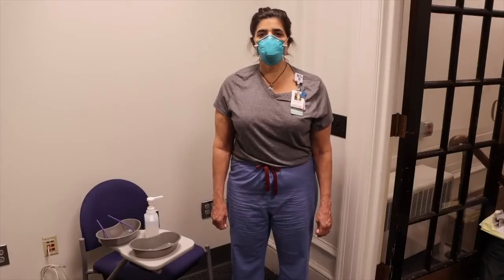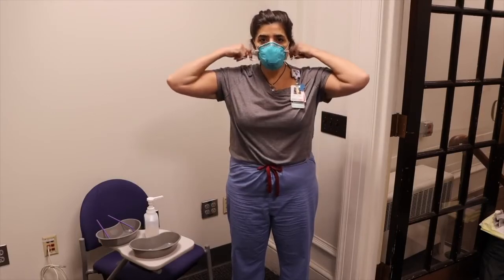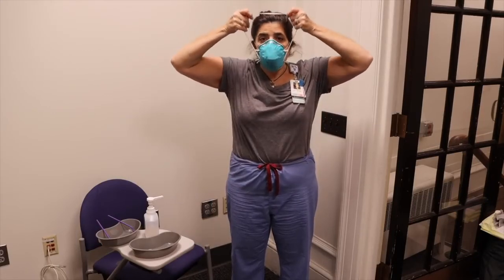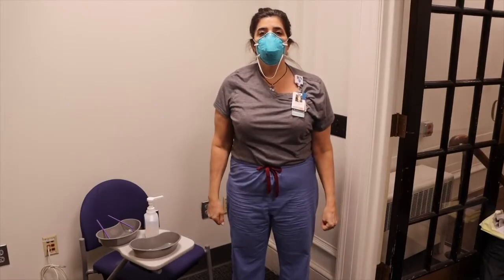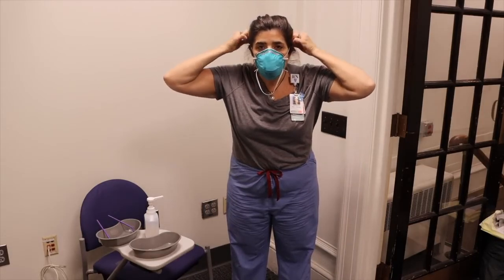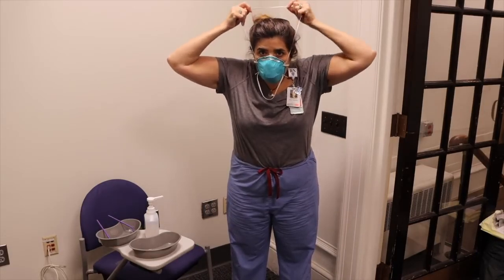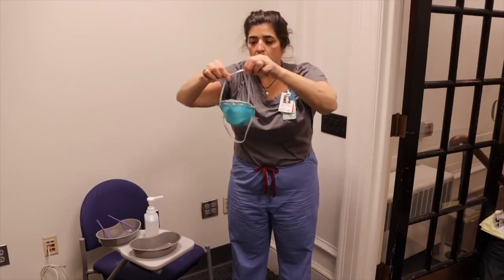To remove the N95 respirator, begin by grasping at the back of the head the bottom strap of the respirator, pull over your head and let hang. In a sniffing position, grab the top strap, pull over the top of the head gently and doff the respirator.